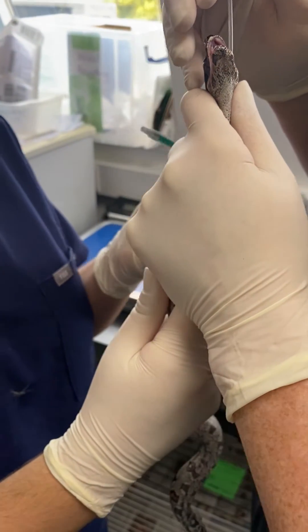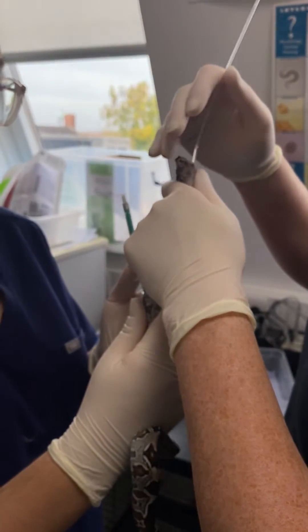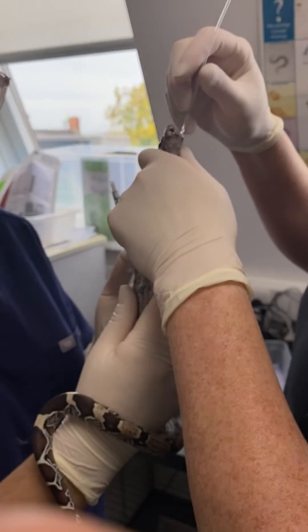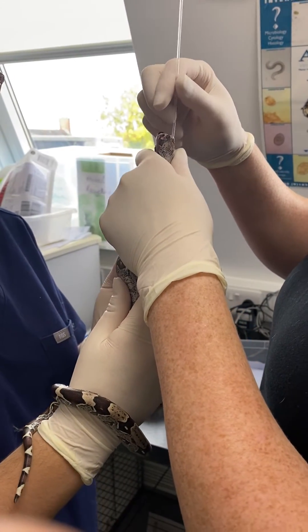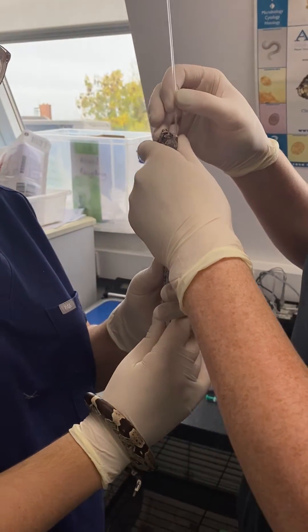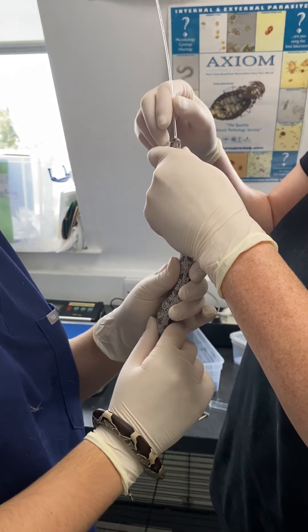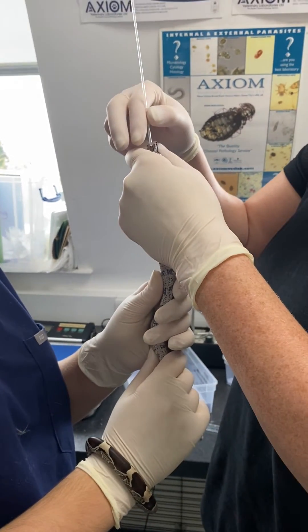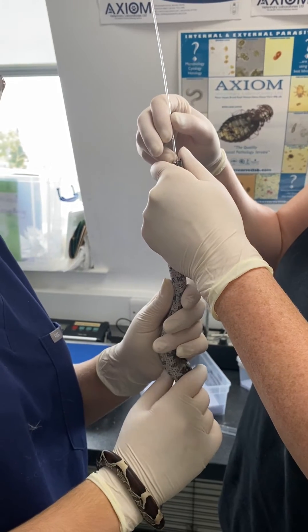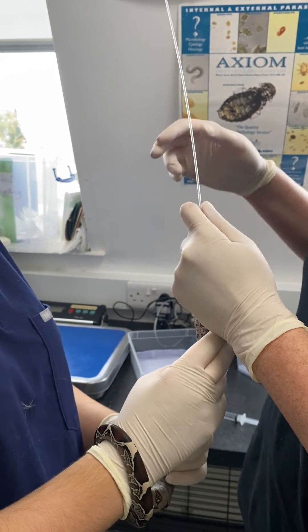Heather, would you mind straightening the snake out so it's held vertically? Fantastic. That's just going to allow things to easily go down. We've pre-measured this tube and we are placing it between 33 and 50 percent of the snout-to-vent length in this snake. Keeping him nice and straight — we don't want to put any overt pressure on this tube, just let it gently slip down.